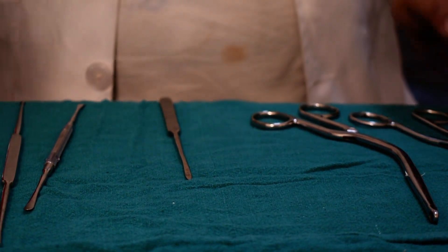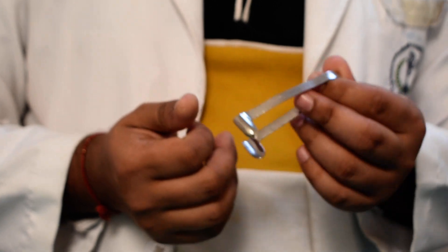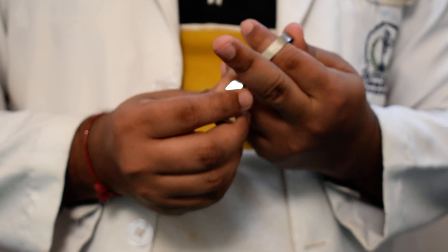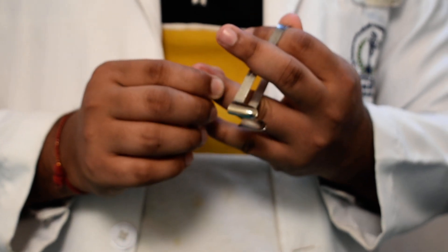I would like to tell you about the Thudicum nasal speculum. This is named after J.W. Thudicum. We hold it between the index finger and thumb, rest it on the ring finger, and move it with the middle finger.